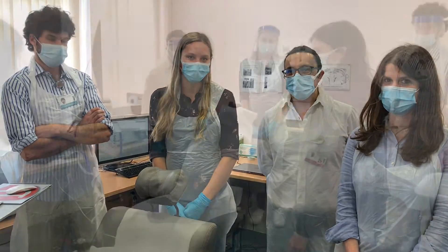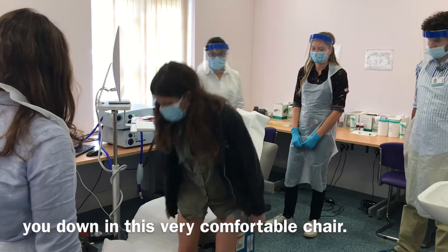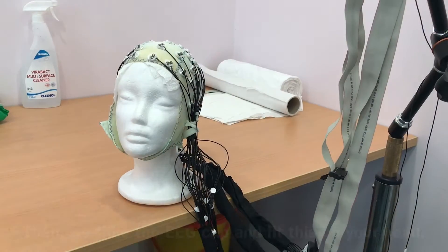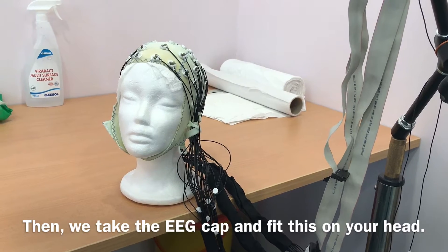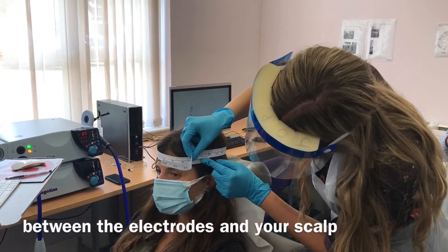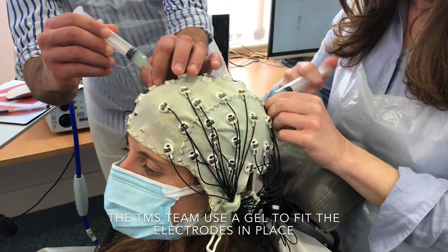First, when you come to TMS, we will sit you down in this very comfortable chair. We will first take the EEG cap and fit this on your head. We try to get a really good connection between the electrodes and your scalp so we can get a nice, clean recording. And this takes around half an hour.